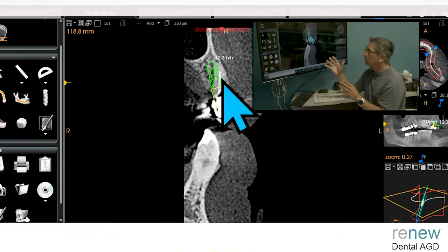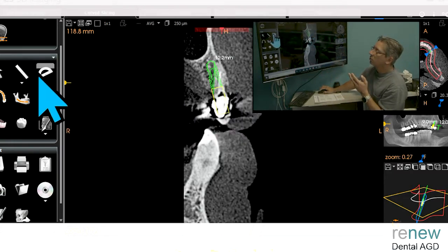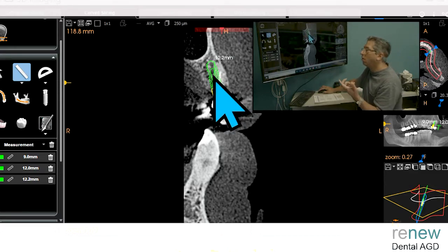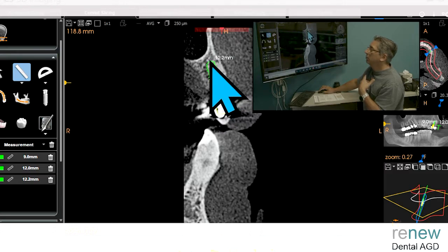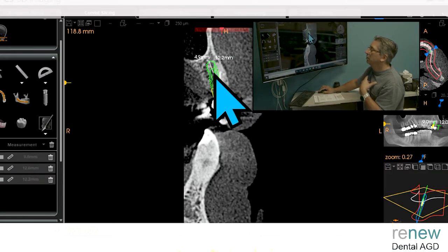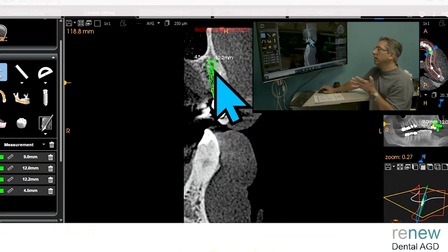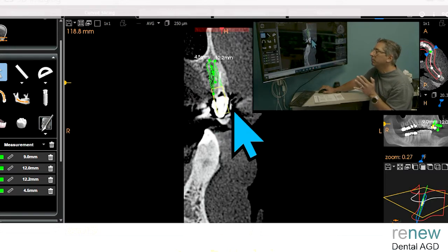it doesn't have all the walls that you really want. It has some of the walls, and one of the rules is to have the implant in 4 millimeters of bone all the way around, and you certainly don't have it. But let's just see where 4 millimeters actually is. So we're at 4 or 5 right here. So you're just getting it into that realm, but you really have a tricky entrance to try to get that drill just exactly like that.